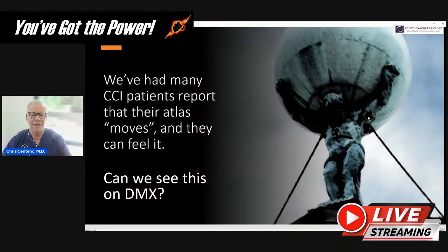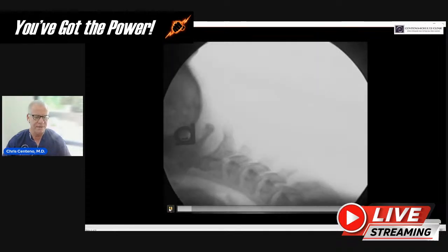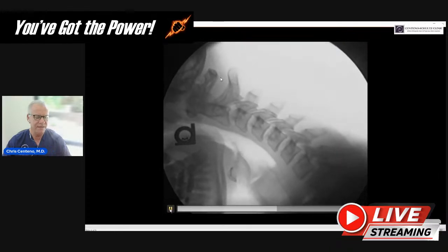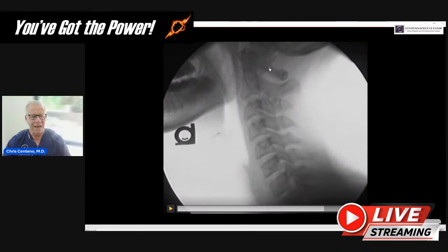So again, this has been a constant report from patients. So the question is, can we see it on DMX? I don't expect that we'll be able to see all of these on DMX, but we can see some of them. So this is what I want you to watch here, and this is Dr. Katz. And you're going to see as this patient comes back up that the Atlas here kind of jumped. It went suddenly down much more quickly.